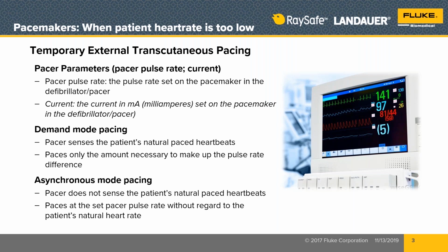Right. And for that reason, there's not a lot of asynchronous pacing that really goes on much anymore. Mostly we're doing demand pacing. And sometimes even in temporary external pacing, sometimes multifocal, which just means that we're pacing more than one chamber of the heart at the same time and in an appropriate way. So if you hear some of these terms when you're talking to the clinicians in your facility, you'll know a little bit more about what they mean.